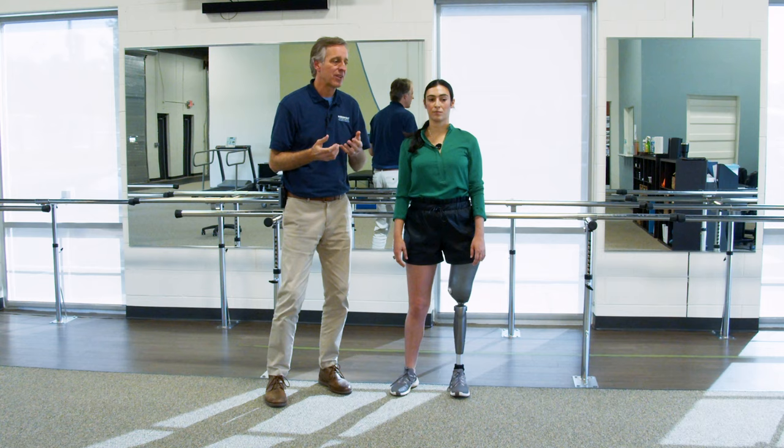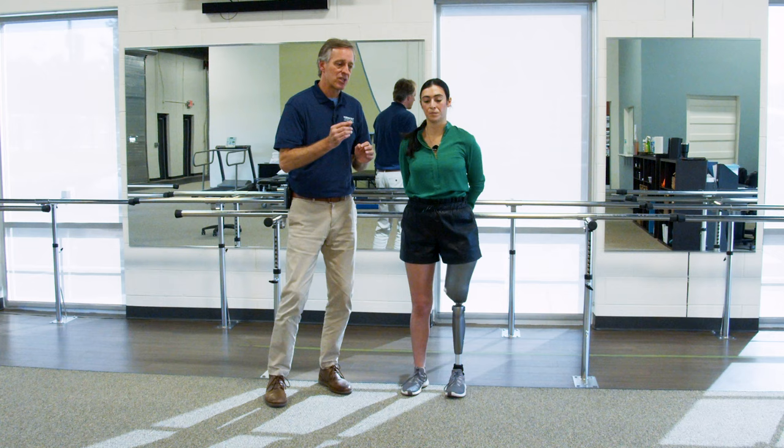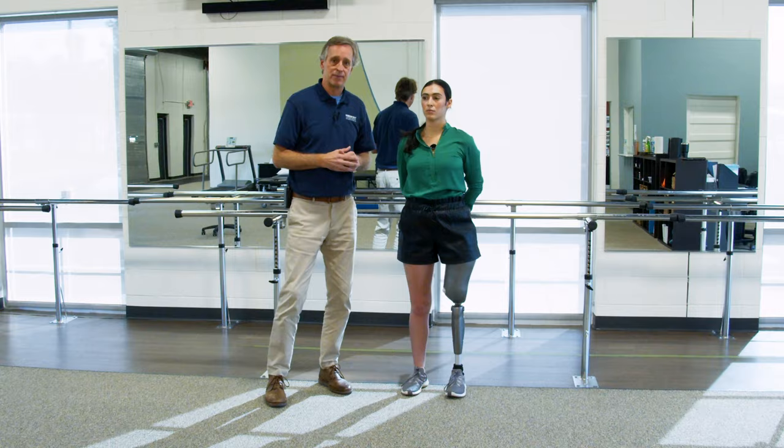Now, just so you know, in every patient, that's going to take time. It's not going to happen overnight. It's going to take weeks to months to really establish a sense of feeling of control and a feeling of confidence over their prosthetic limb motion.